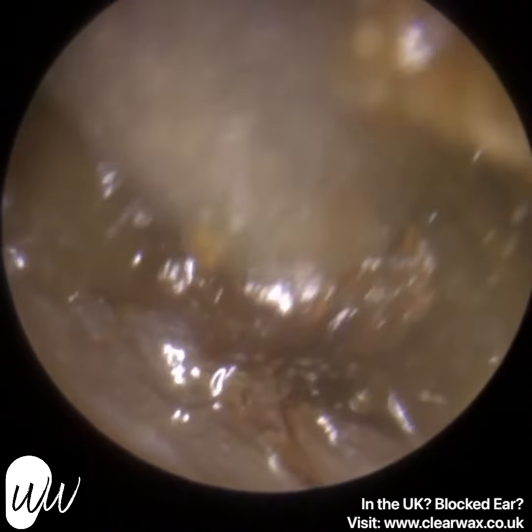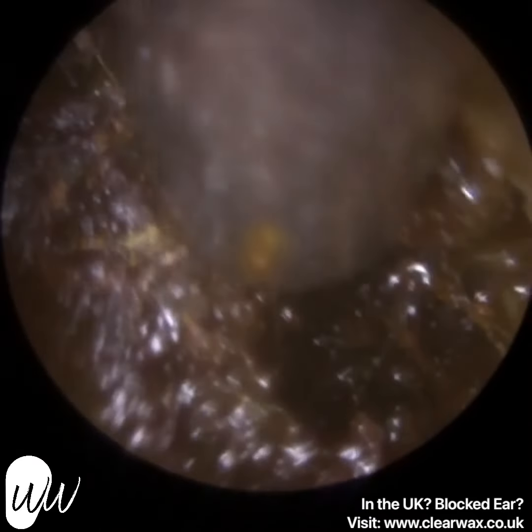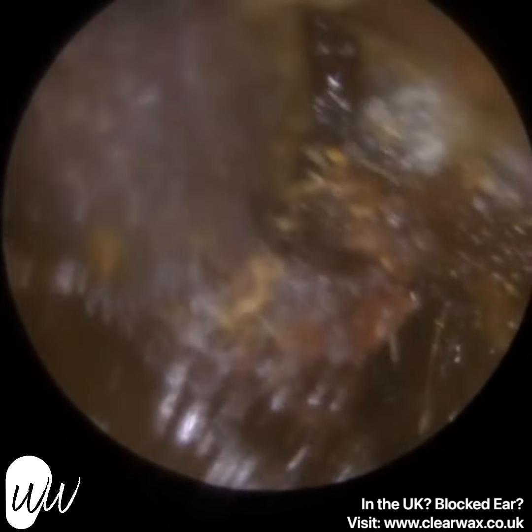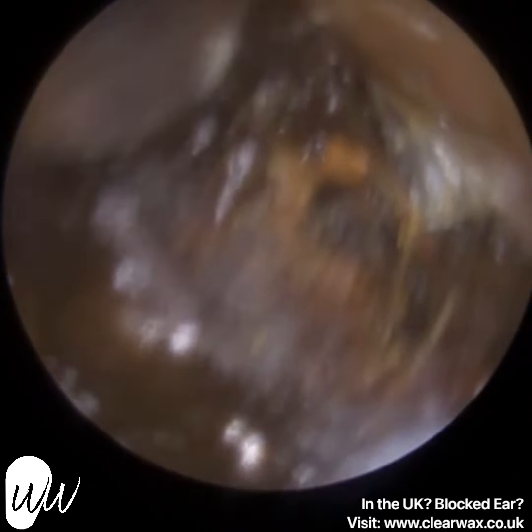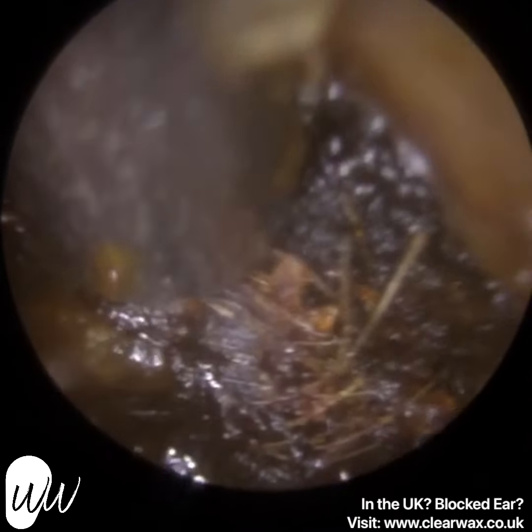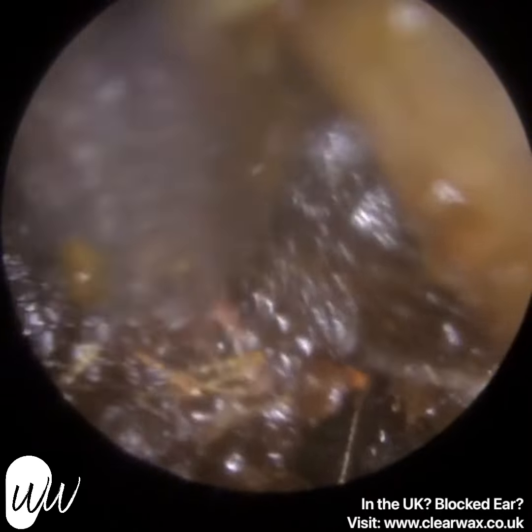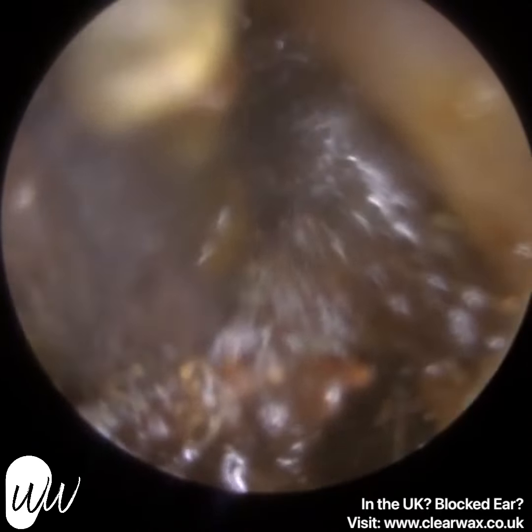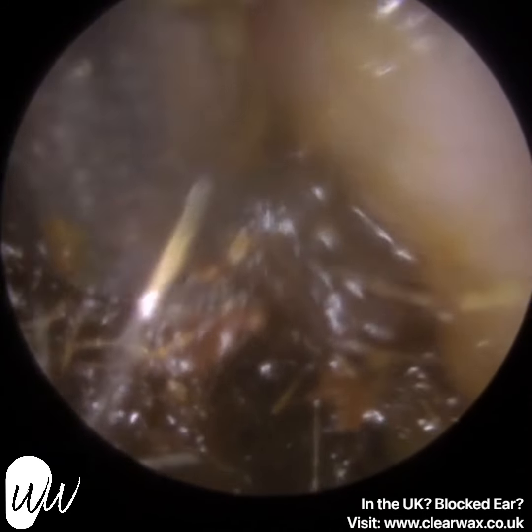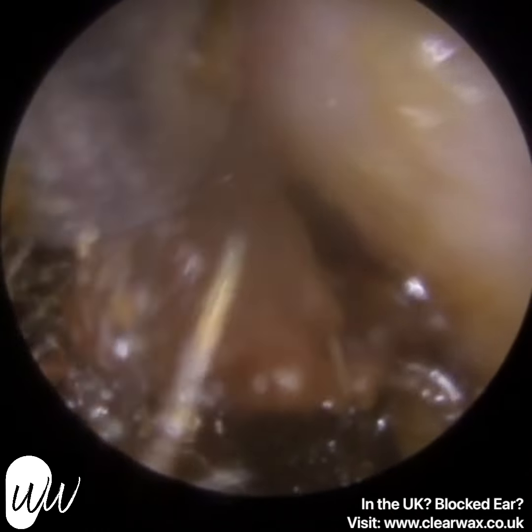So I've just put a lot of olive oil in here just to change the consistency again. And I'm suctioning whilst the oil's in the ear. That's why occasionally it gets blurry, because I'm suctioning the oil as well. And you can imagine the light refracts differently through oil, as it does with water, compared to air. Just at the entrance, but it's just lodged here now. So we've got half the wax plug out, but this more medial bit, I've brought it forwards, but it's just trapped at the entrance. The entrance of the ear was a bit more narrow and slit.